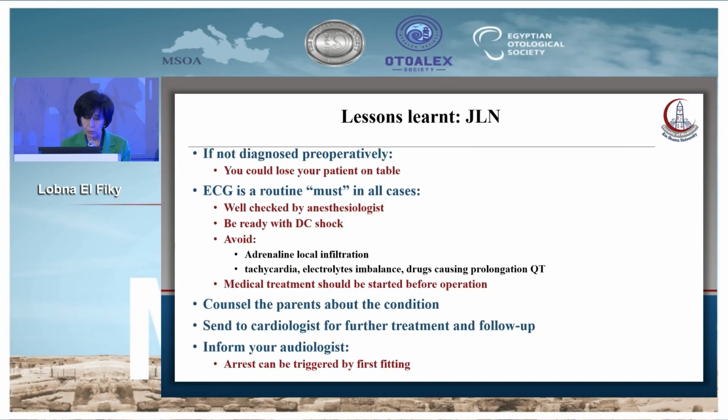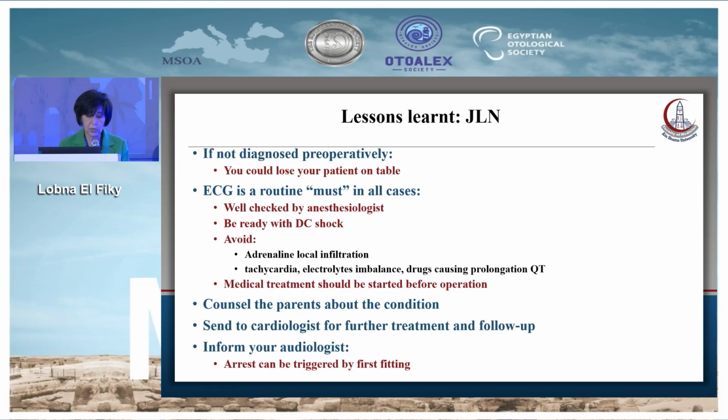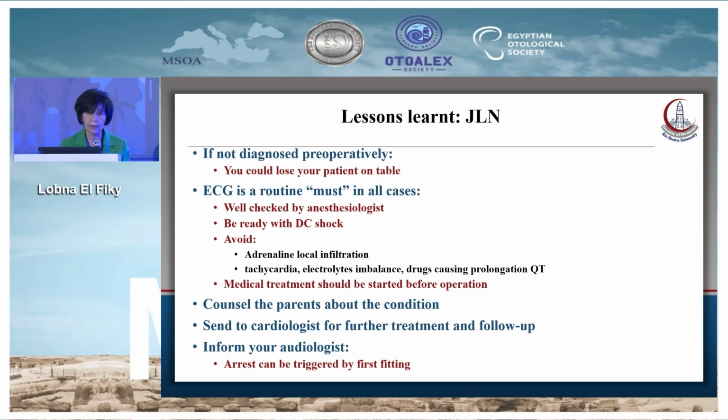We learned a lot and we have a lot of lessons from the JLN, because if not diagnosed preoperatively, you might lose your patient on the table because of cardiac arrest if you are not prepared for it. Of course, ECG is a routine in all cases of those children, which is not common to do for children preoperatively, but not in cases of cochlear implant.